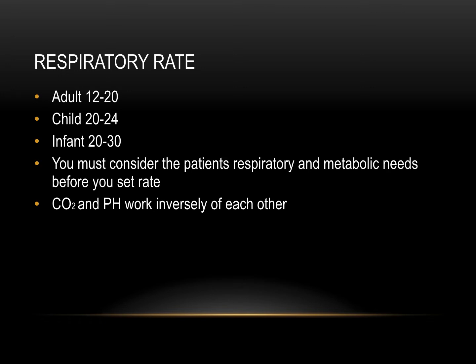So if we come along, we paralyze, intubate them, and put them on a respiratory rate of 16, all you're doing is giving them a kick in the butt, pushing them towards death's door, and that's not what we're here trying to do. So when we put someone on a respiratory rate, you need to consider respiratory and metabolic needs of the patient, and that goes for BVM as well. You can't just bag someone at a normal respiratory rate when they need a higher respiratory rate.